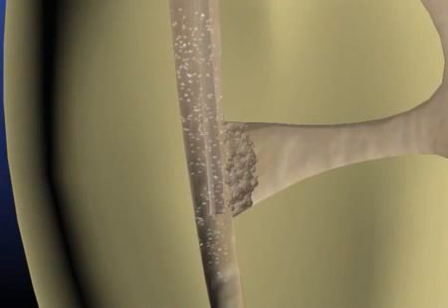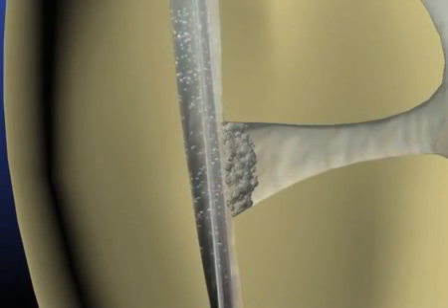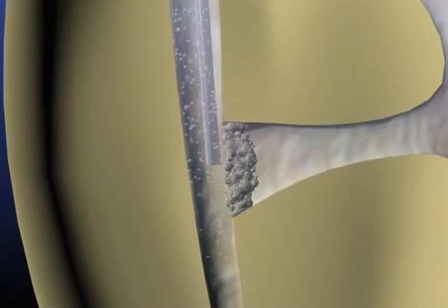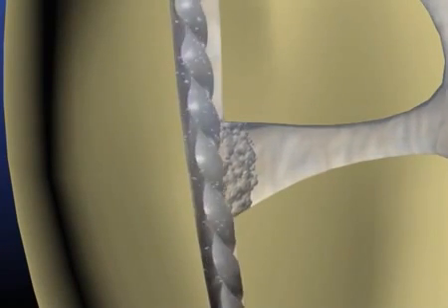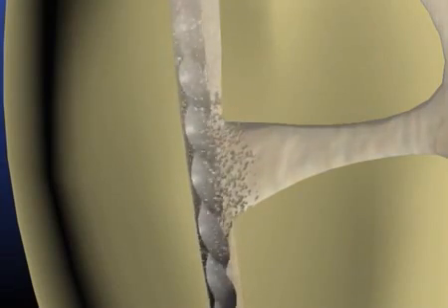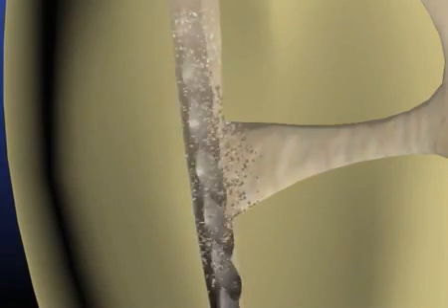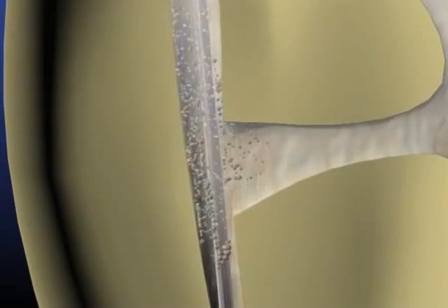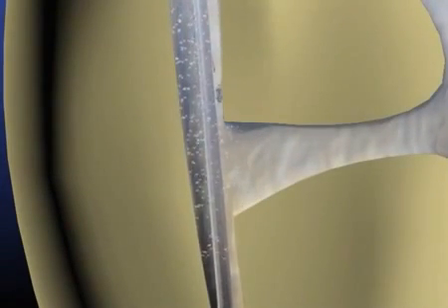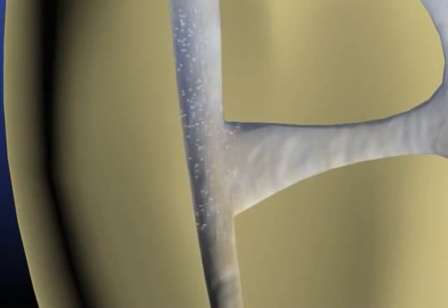To mitigate blocking the lateral anatomy, after each rotary instrument, irrigate to flush out gross debris. Recapitulate with a small 10 file. A small size 10 file moved in short amplitude vertical strokes breaks up debris and moves it into solution. Now re-irrigate. Re-irrigation liberates residual debris.